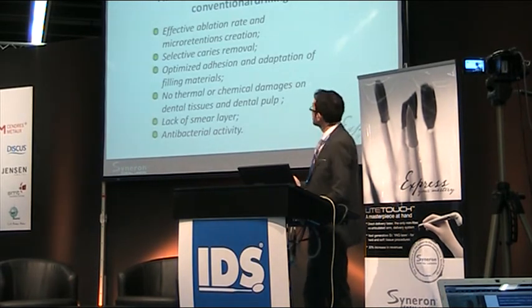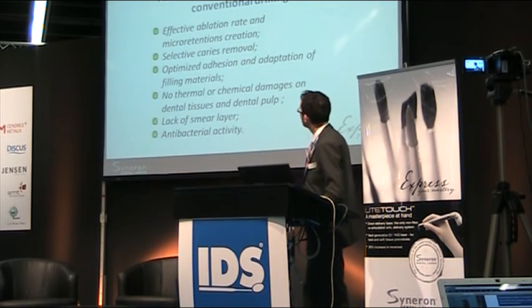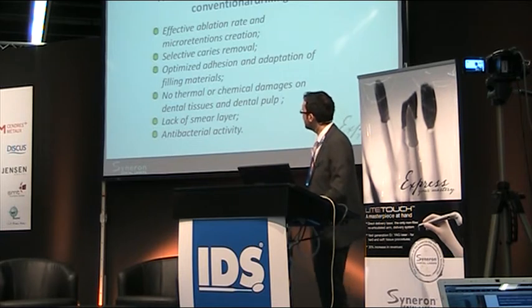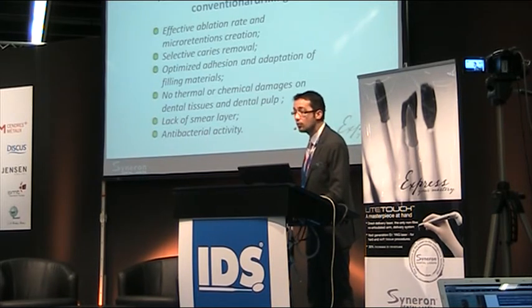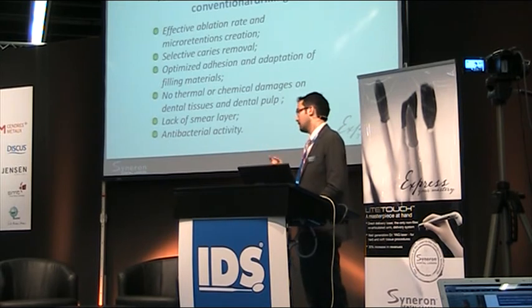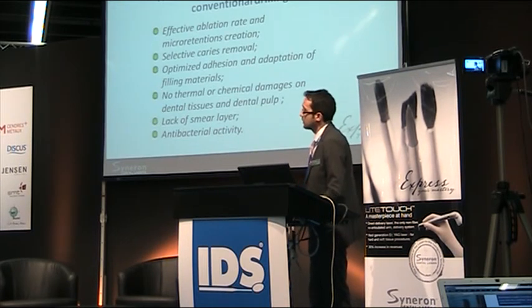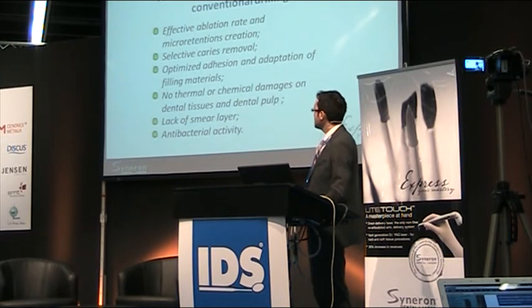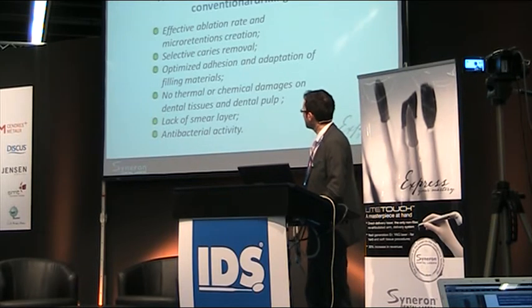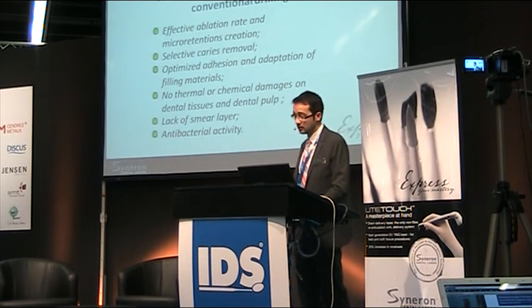So if I have to summarize these results, we have some advantages of laser ablation versus conventional drilling. We have effective ablation rate and micro retention, selective caries removal, selective because the caries contain more water, and this water interacts with the wavelength of the laser. There is an optimized adhesion and adaptation of the filling material. There is no thermal or chemical damage of the dental tissues, lack of smear layer, and also antibacterial activity.